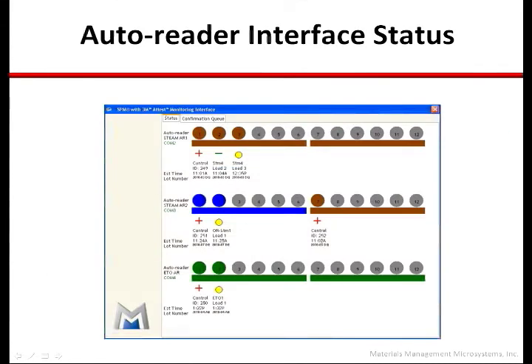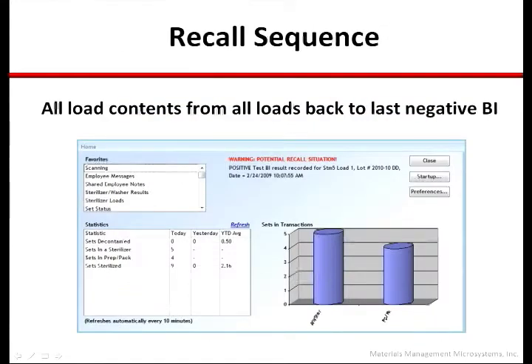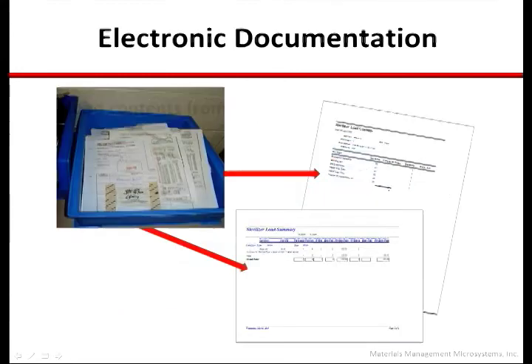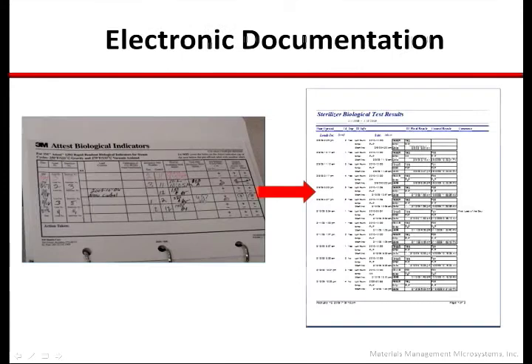This is an at-a-glance status screen for the auto-reader interface. It shows all auto-readers in use — in this case three different ones — what products are running: brown caps, blue caps, or green cap BIs; whether they are test or control BIs; the sterilizer and load number information; and the time when the final read will be available for confirmation. In addition to workstation messaging, this desktop alert overrides all activity on the manager home screen so critical recall information is provided and available real time. In addition to moving to a paperless environment for all record keeping, this data is now useful for reporting and decision support.